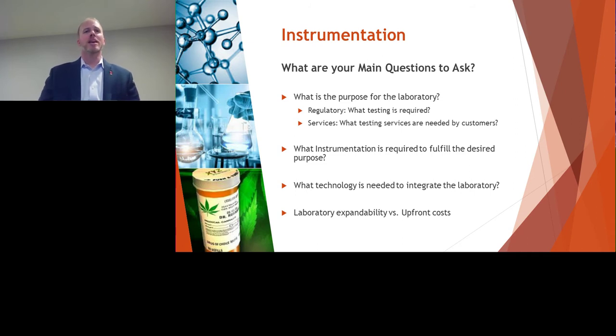And then the final component, if you're setting up a new lab from scratch, you want to think about what long-term goals you have for your laboratory. So the instrumentation, what is their capability, not only on the tests and the analytical methods that they can do, but how quickly samples can be pushed through. And you may spend a little bit more upfront to have some rapid capabilities or some expandability versus buying something that would be inferior to your long-term goals.